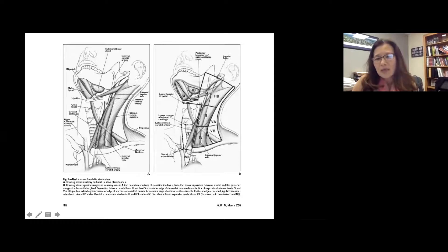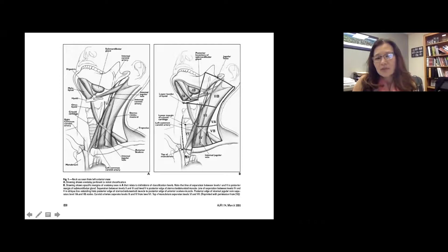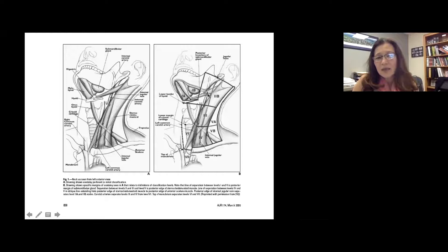The carotid artery is also a very key structure, because medial to the internal carotid artery or common carotid artery would be level six, and then below the sternum would be level seven lymph nodes. The 2A and 2B subdivisions are divided by how close they are to the internal jugular vein, and 5A and 5B are divided by the level of the cricoid cartilage.